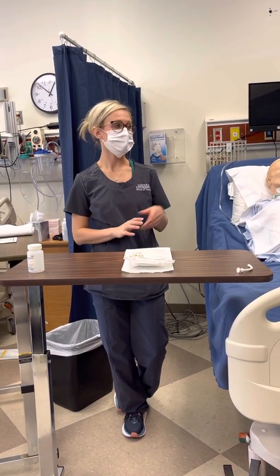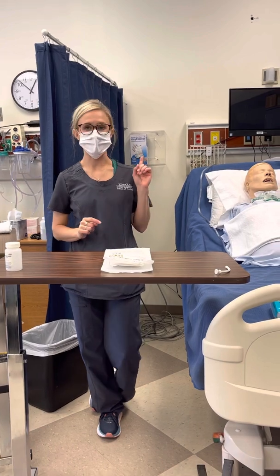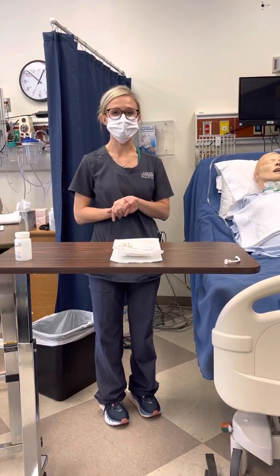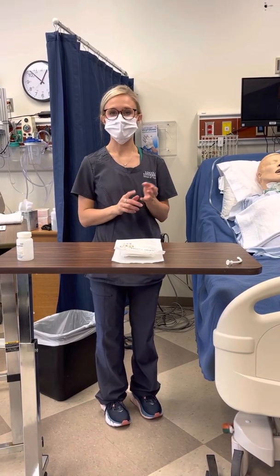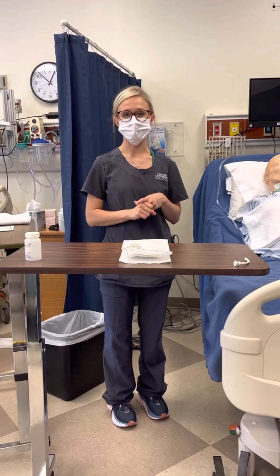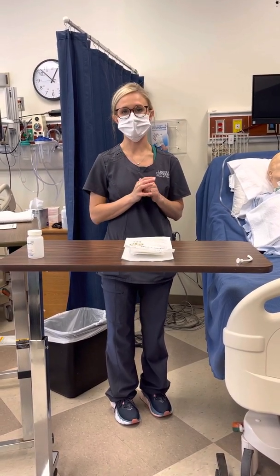Before I begin, I'd make sure that I have the suction turned to 80 to 120. I would make sure that my patient is hyperoxygenated. I would do an assessment. I would check his lung sounds, his heart sounds, and his oxygen level, and do a complete set of vital signs.